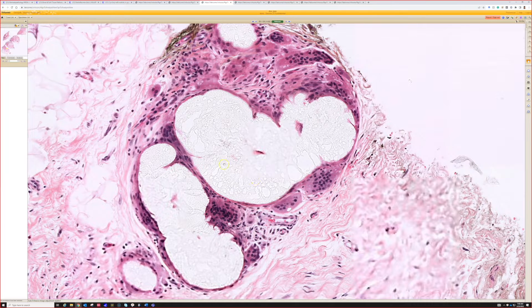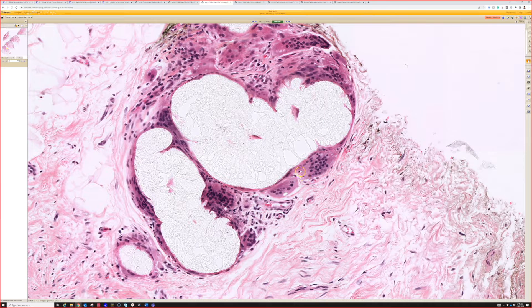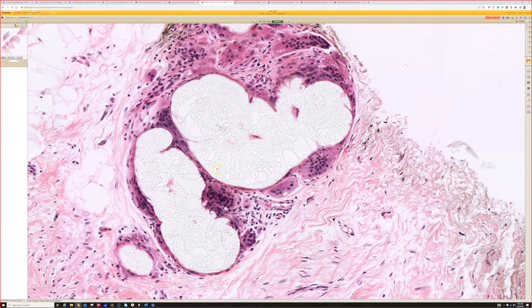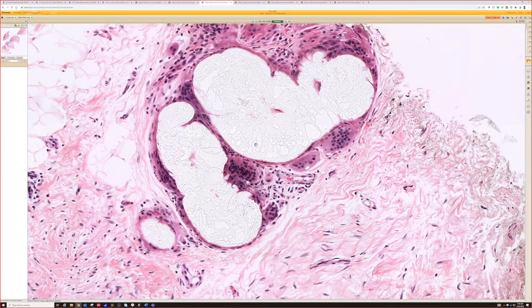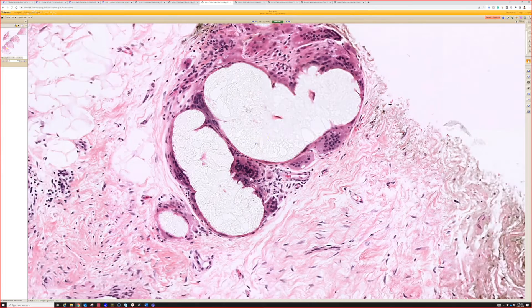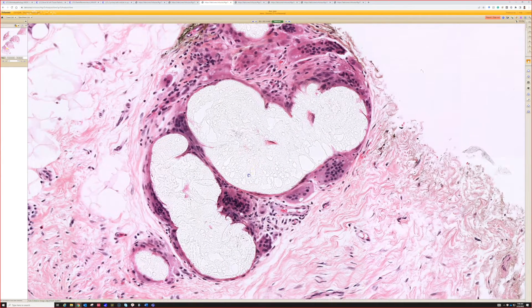The body seems to think something doesn't belong here. We've got a foreign body giant cell reaction forming a foreign body granuloma around this aggregate of clear, fragmented material — it's kind of like a regular little sheet-like material.